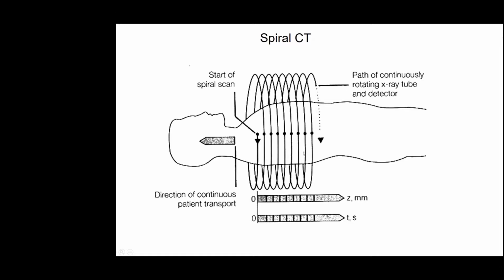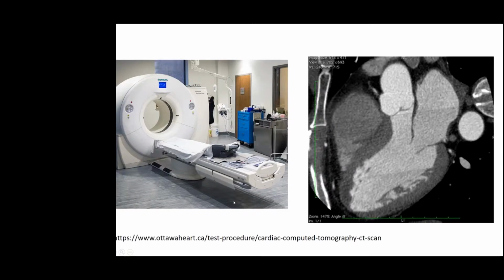You can use this to reconstruct a three-dimensional picture of the body in terms of just attenuation of X-rays, which is possibly the main limitation here. This is a sample CT scan, and this is one sample image. There's nothing in particular about this image.